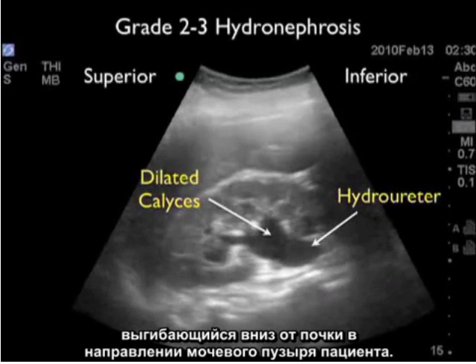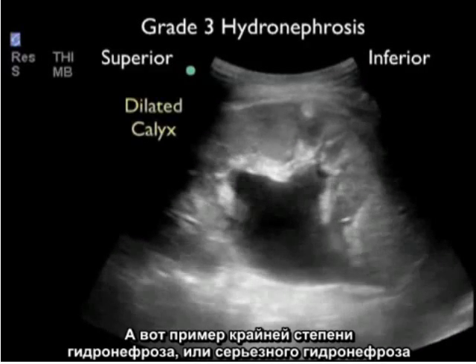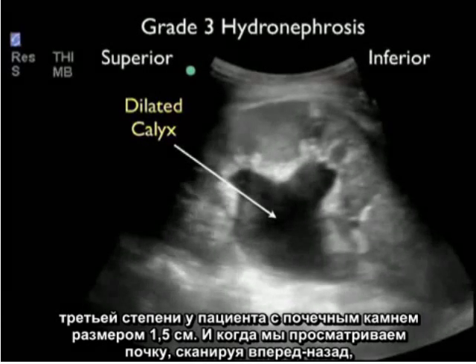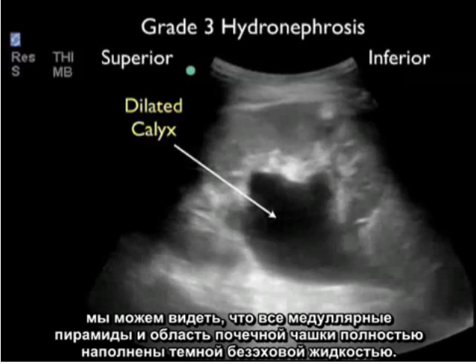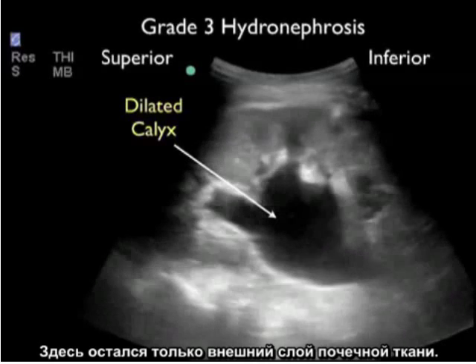Here's an example of the highest grade hydronephrosis, severe or grade 3 hydronephrosis, in a patient who had a 1.5 centimeter kidney stone. And as we look through the kidney, scanning back and forth, we can see that all the medullary pyramids and the calyceal region is completely filled with dark or anechoic fluid. All that's left here is the outer cortex of renal tissue.